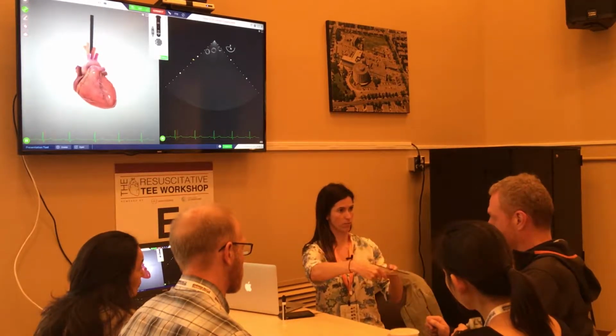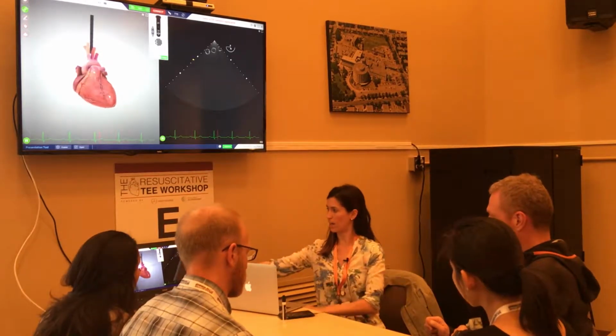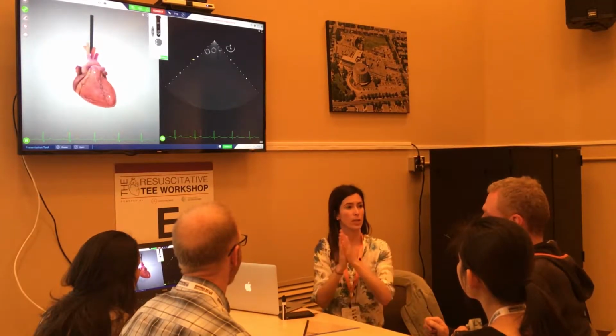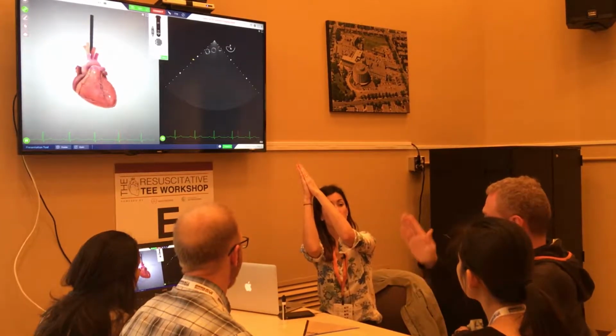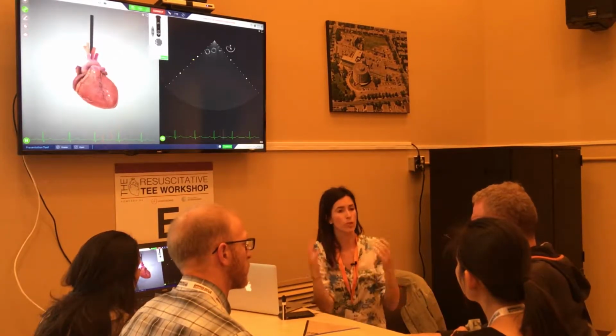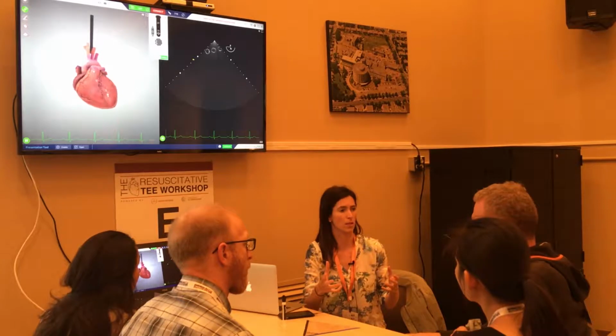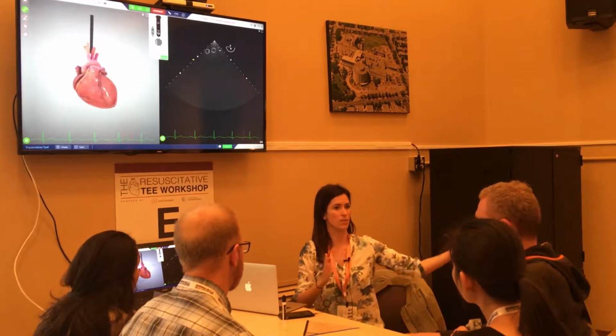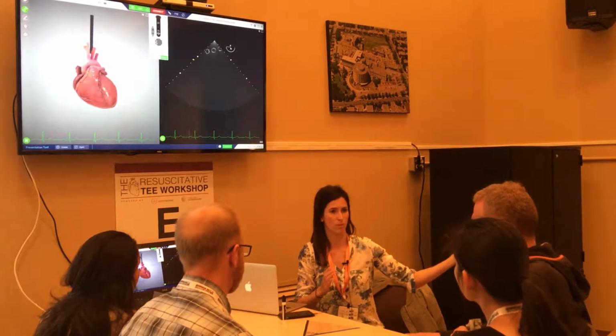So we take this, right? And it helped you to kind of have this in front of you. And then I take this, putting that up on the screen, it's going to be your right side. So we have the brachiocephalic trunk that then splits further up into the right common carotid and the right subclavian. We don't see that on our ultrasound. On the left side, you have the left common carotid in the center, and then the left subclavian off to the left. Okay?